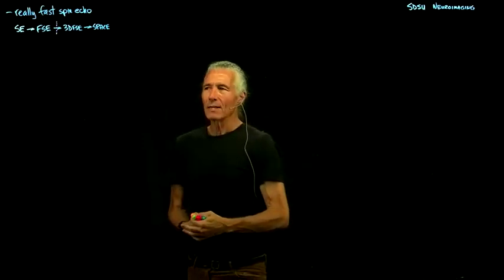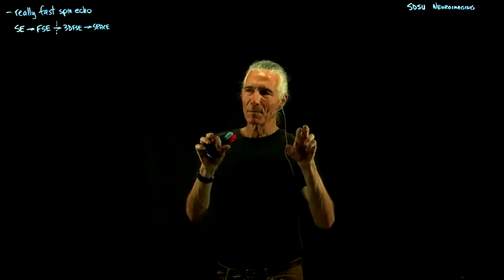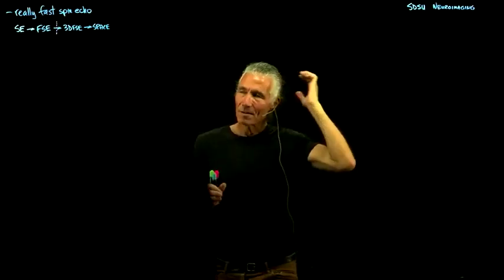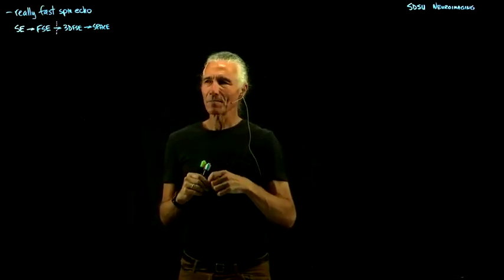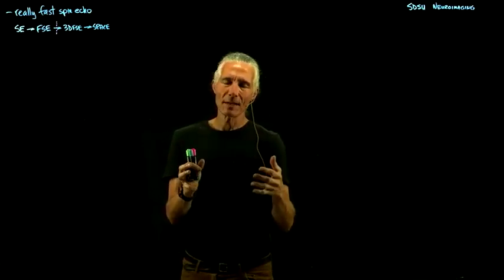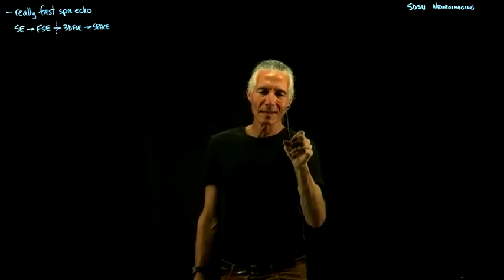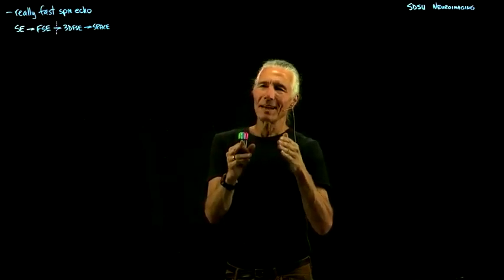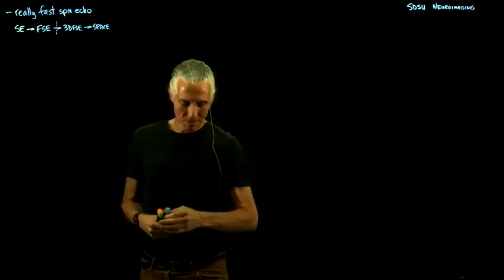So if you do a 3D version of a scan, it's much easier to get thinner slices, and we put slices in quotes because you're actually not activating slices when you do a 3D scan. What you're doing is essentially stimulating the entire brain for every single data point, and so you don't really have slices until you do the inverse Fourier transform, and then you end up with slices. So the scanner interface is a little bit inconsistent. It'll say how many slices do you want? It's not really slices. It's just how many data points in the KZ direction you are recording. That's actually what the slices parameter changes.